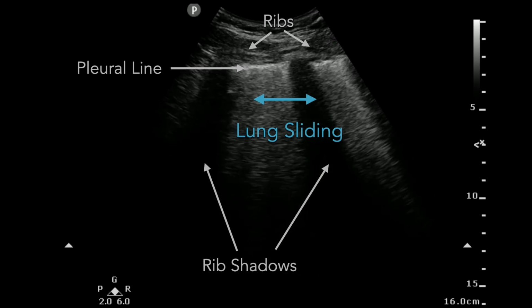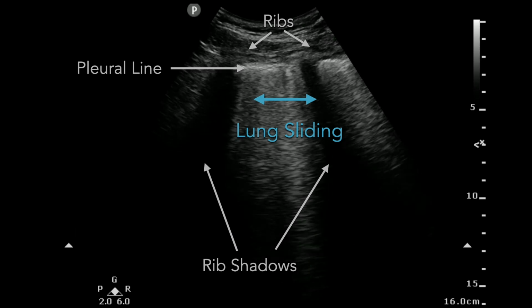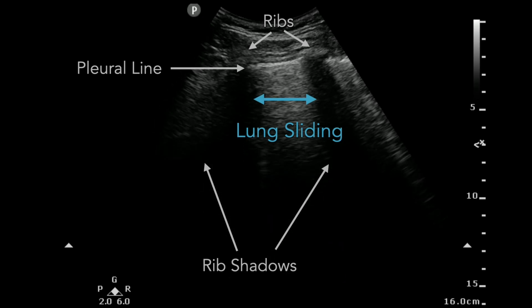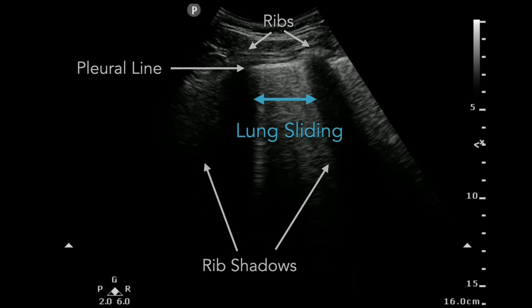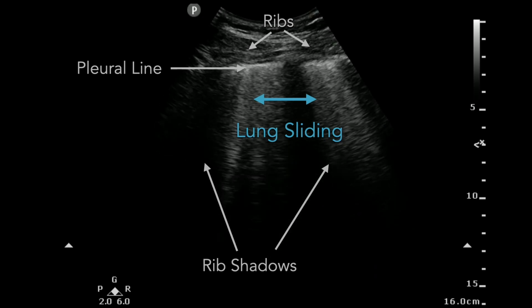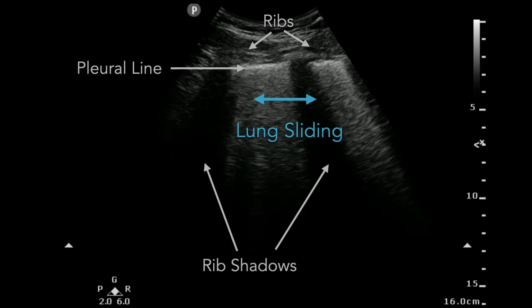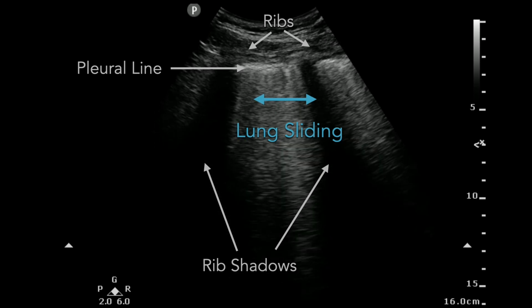And what I've learned to do through reading, studying, and also some trial and error is when you find this, put it down in the middle of the chest, but then scan up to the clavicle, right? Then once you've done that, scan all the way down to the diaphragm, right? And so you're viewing the whole anterior chest. And it doesn't take long. You put it down, go up to the clavicle, great. You pause a second on each rib space. There's only a few of them, so it only takes you 5 or 6 seconds. And you want to watch that lung sliding happen at each rib space. And if you do that, you can say that there is positive lung sliding at all those places, which means there is no pneumothorax in that anterior lung field, right?